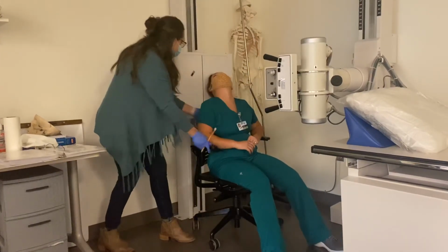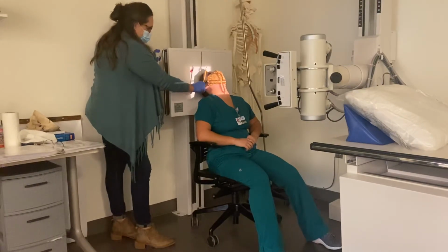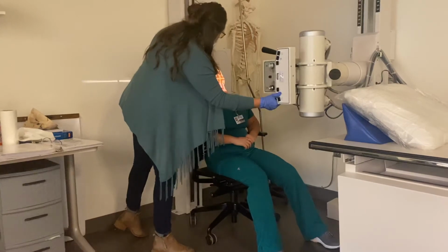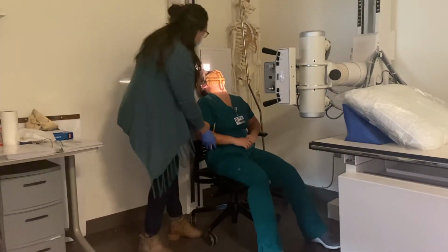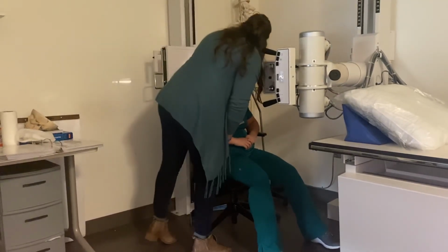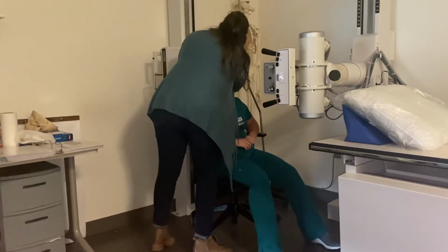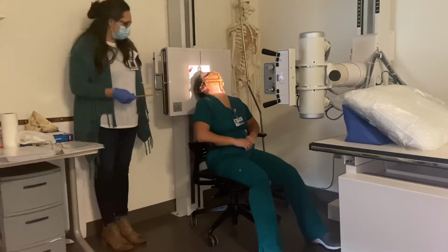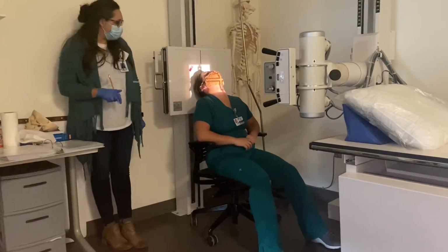Okay, go ahead. So for this one, we're wanting the IOML, the infraorbital meatal line, parallel to the IR. And then what we want to do is center midway between the gonions. This board's going to move just a little bit. We want to be still kind of at that mid-sagittal plane, and then we need to double check that there's no rotation. I'm going to twist you just a little, sorry. All right, so that there's absolutely no rotation on this one. And again, that IOML is parallel to the IR.